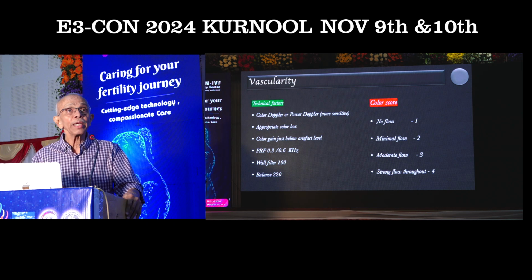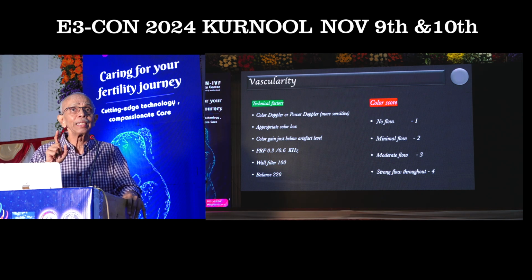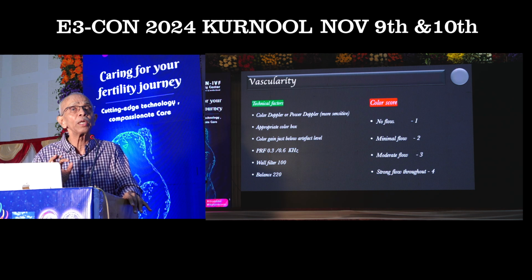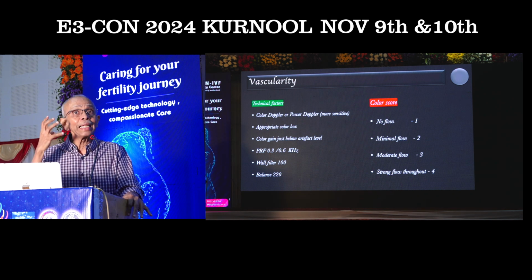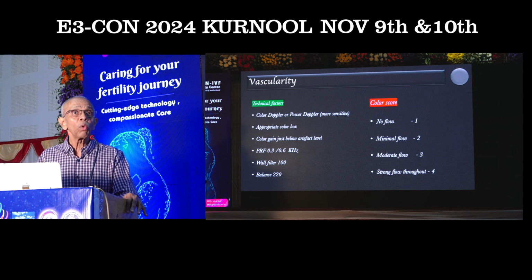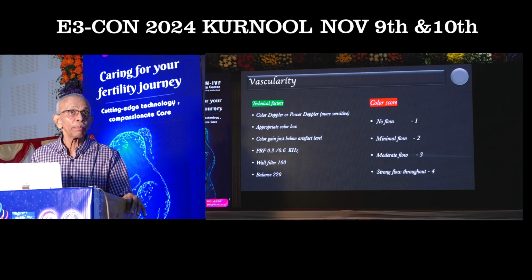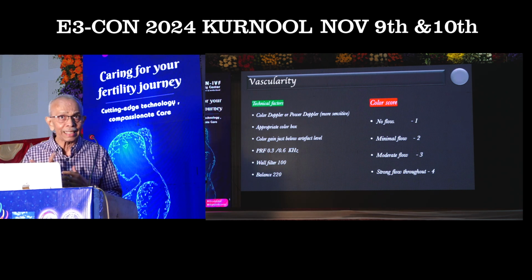So whenever we try to evaluate the vascularity of an adnexal lesion, the most important thing is we need to be very, very appropriate with our technical factors, that is your settings, the Doppler settings which you are going to use. For that, most often we can use either a color Doppler or a power Doppler, preferably a power Doppler, because power Doppler has got higher sensitivity.